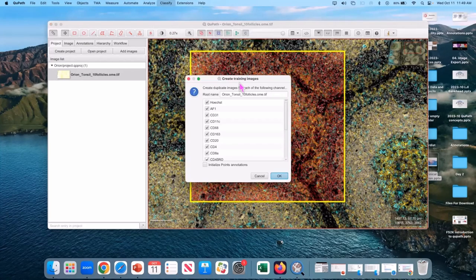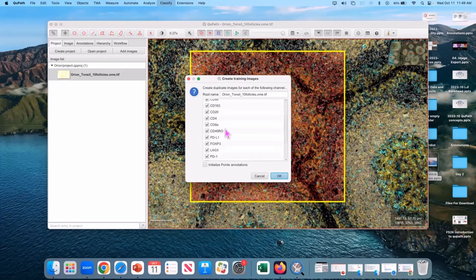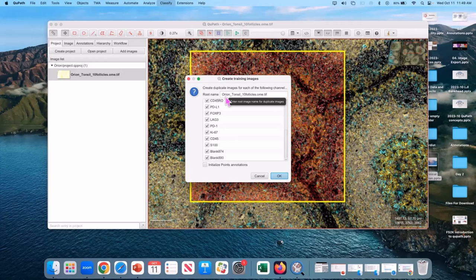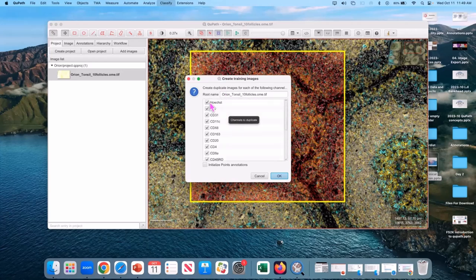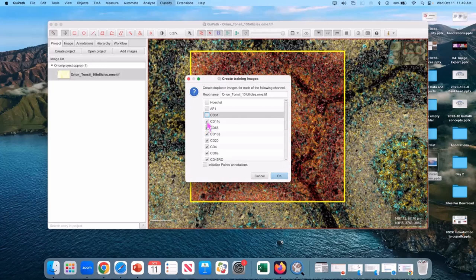And this gives you the option of, at this point, 20 images each labeled with a single channel so that you can focus on what you're doing one channel at a time. You can make all 20 if you want, but I'm going to just make a couple. And I want to make CD4, CD20, and FoxP3.